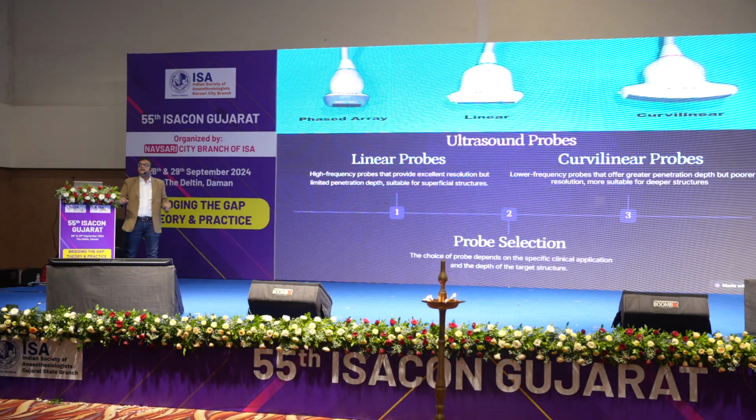And frequency is how many sound waves are generated in a fixed time. So if the probe has a high frequency, it means the previous wave has to come back fast. It means the depth the wave is going to pierce is going to be less. So with a high frequency, your depth is going to be less, but your resolution is going to be good because there is more frequency.